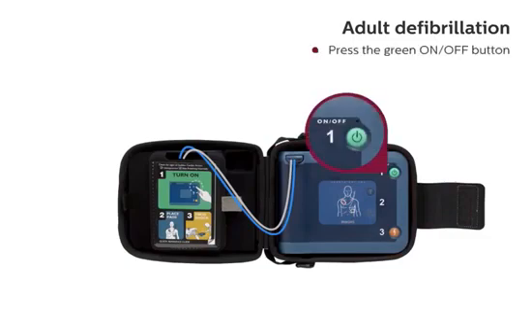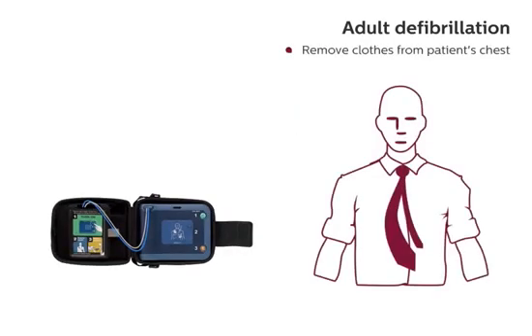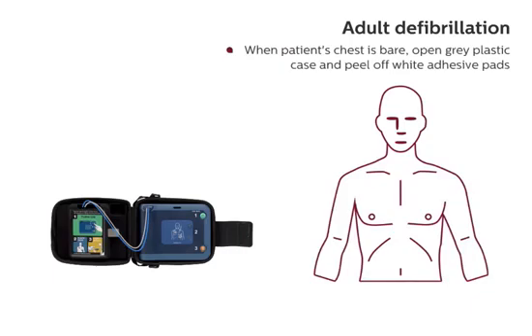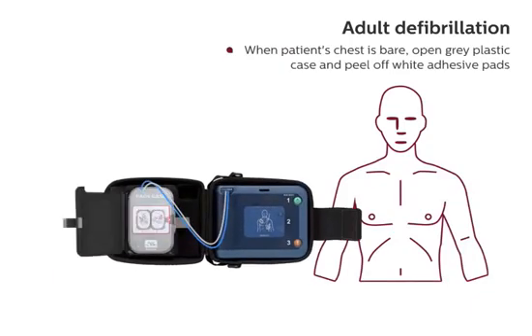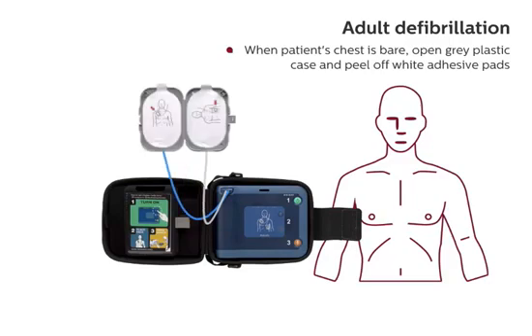To start the defibrillator, press the green on-off button and follow the HeartStart FRX's voice instructions. Remove clothes from patient's chest. When patient's chest is bare, open the gray plastic case and peel off the white adhesive pads.